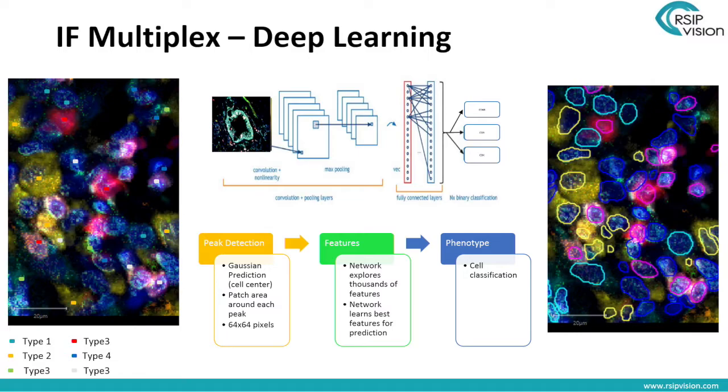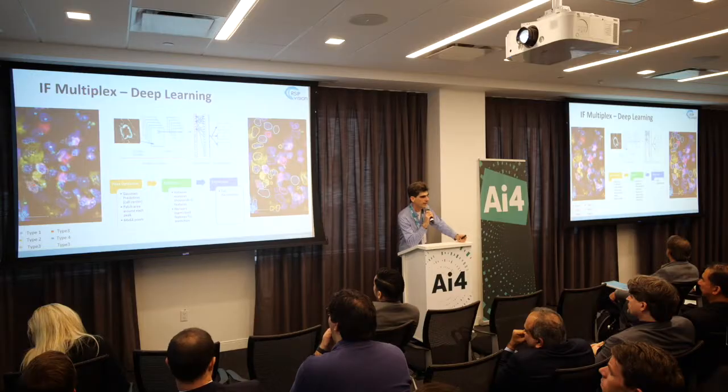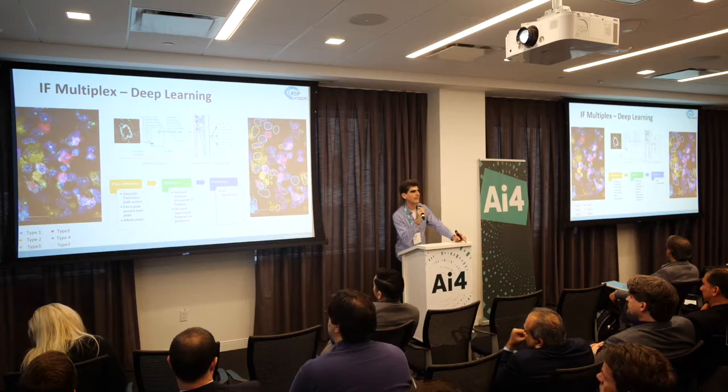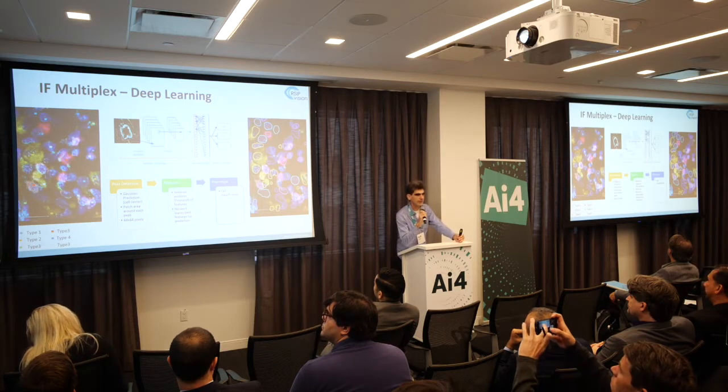In the end, the architecture of the network is a classification network, so you have various layers of convolutions. You introduce nonlinearity in the middle, the usual tricks of the trade for regularization, for data augmentation, etc. Actually, the data augmentation becomes very important in the failure analysis part of the R&D.